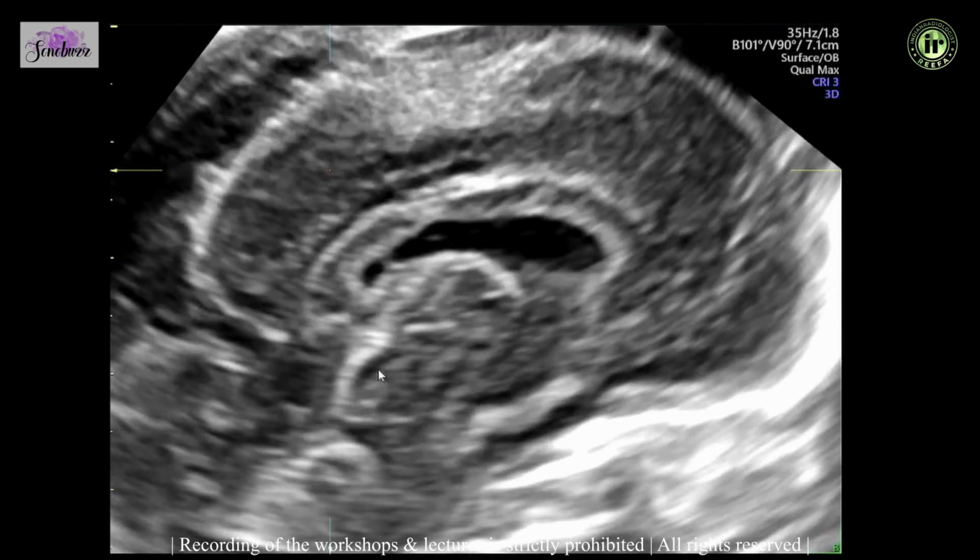That is the tectal plate here, that is the splenium, and that is the end of the corpus callosum. We can also do measurements. You can measure the thickness, and you can see that it's quite homogeneous.